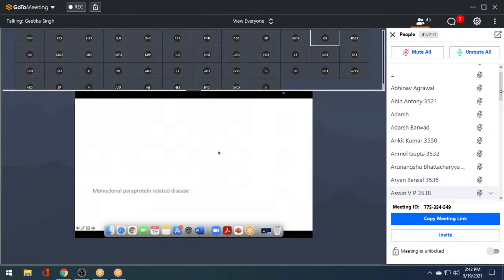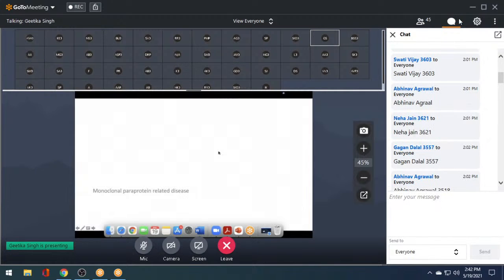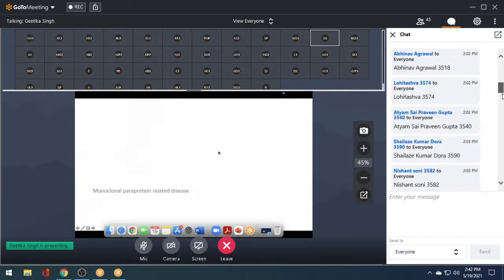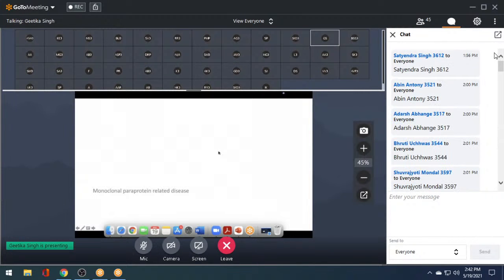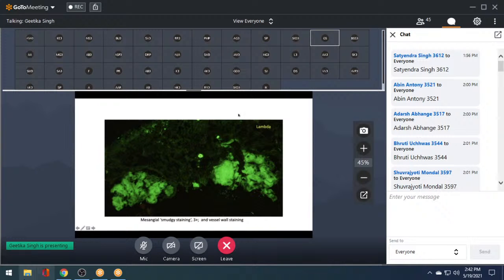Now, sometimes plasma cells produce only one light chain or maybe only a heavy chain. Okay? They are now neoplastic plasma cells. And when they release such things into the circulation and they deposit in the kidney, we can diagnose it because we have immunofluorescence, right? I can tell you whether the deposits in the kidney are polyclonal or whether the deposits are monoclonal very easily in kidney because I can run a direct immunofluorescence. So let's look at some examples.